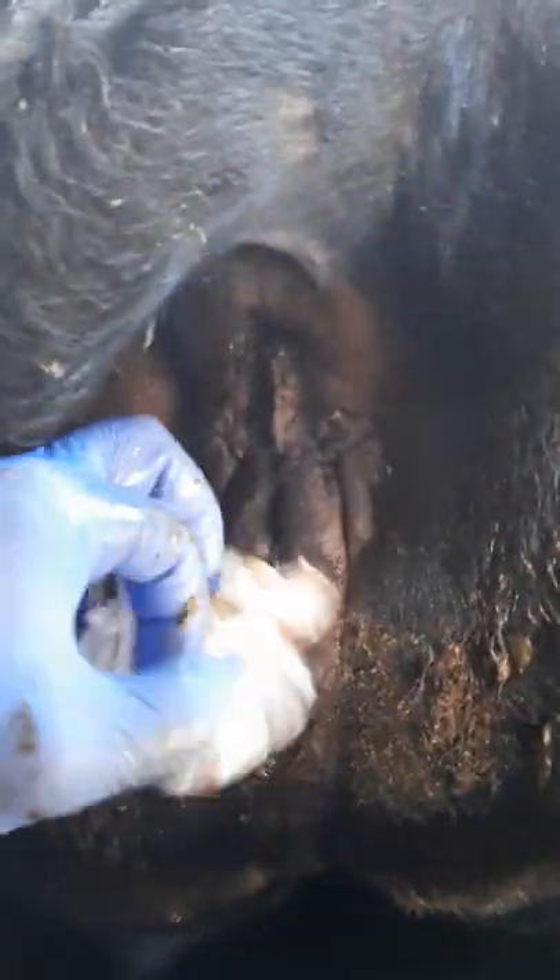Into the animal. Find a bit of paper. Running out of hands. Lift the tail. Clean the back end off as best you can, because you don't want to be taking muck in.